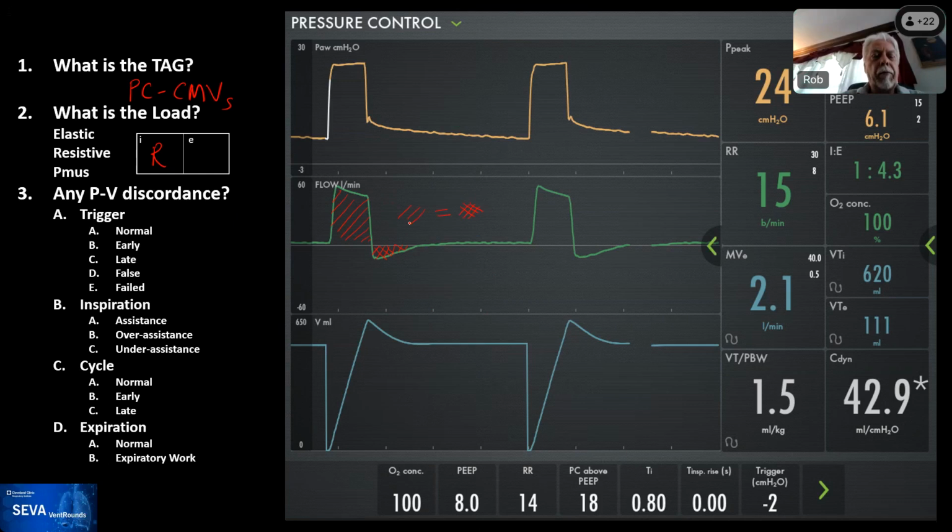Excellent. In this case, they are not, right? Not by a long shot. By a long shot. And actually, we can definitely see up here how the volume increases then it exhales, and actually this amplifies it, and you can easily see how it reaches essentially flatness, and then it resets, boom, and it repeats again. So this speaks that this patient has a very large leak, right? So you can see a massive square root sign, and then you can see the discrepancy between inspiratory flow and expiratory flow.